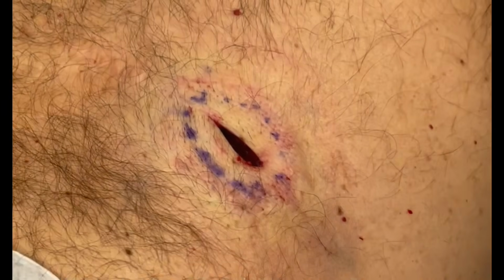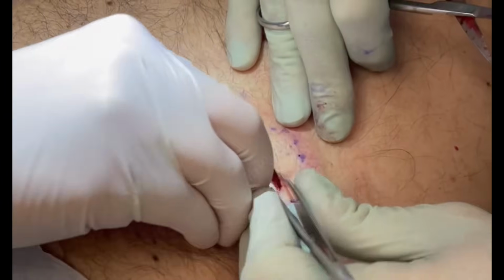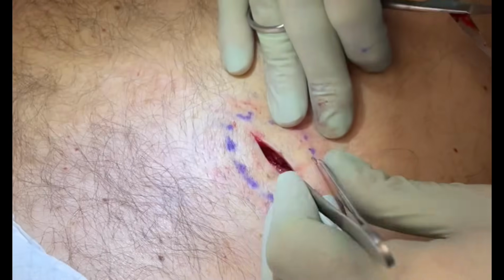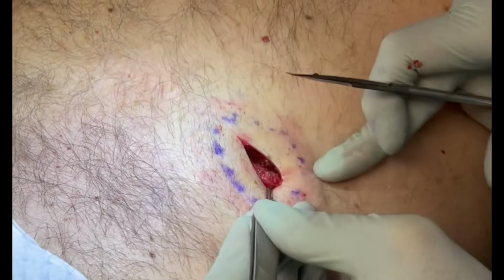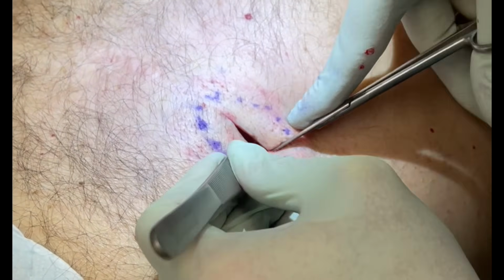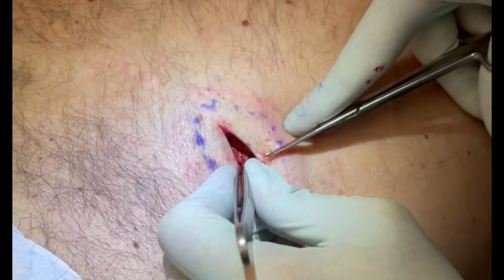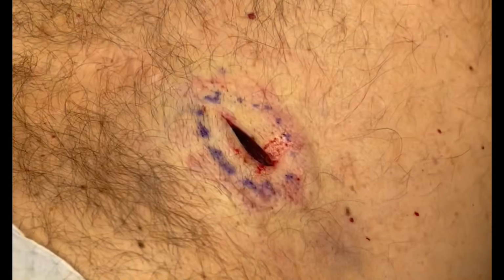I'm glad we did that today. You know, we were going to wait a week or two. That's why I say I can squeeze people in. These don't take all that long. It's good to get them out. That's right. No sense in waiting. A little fascia right there. That's good.